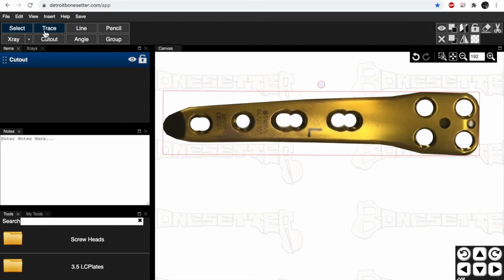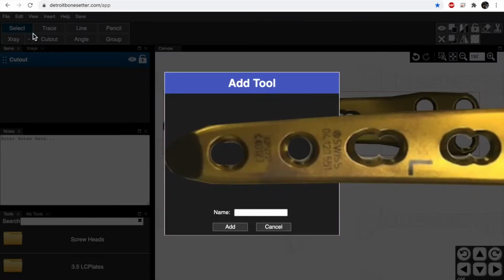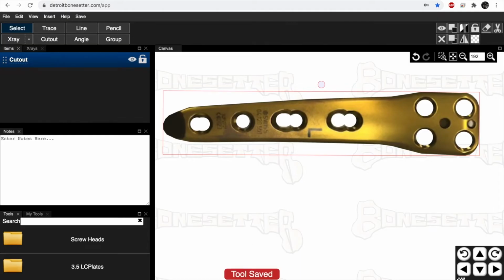And so I'm going to go to edit, and it's going to say add item to my tools. And so I need to give it a name. So this one would be a medial femoral Tomofix plate, and it's left-sided. You can see that left. There we go. And I'm going to put add, and it says tool saved.